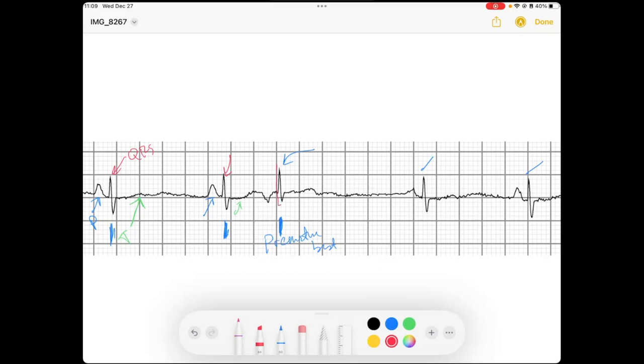So, I see that the QRS complex looks very similar to the previous QRS complex. And so, I know that that means that it's taking the same ventricular depolarization pathway via the AV node as the previous beats. So, I look in front of it, and I say, do I see any atrial activity before this beat? And I see, right here in this box, this nice P wave that is what caused that QRS to occur.